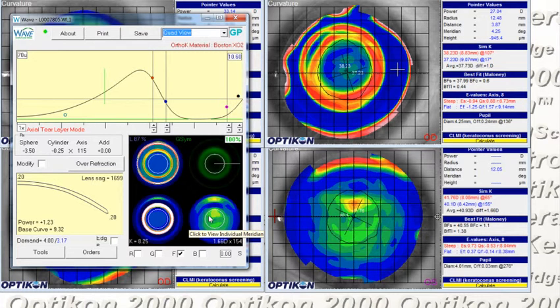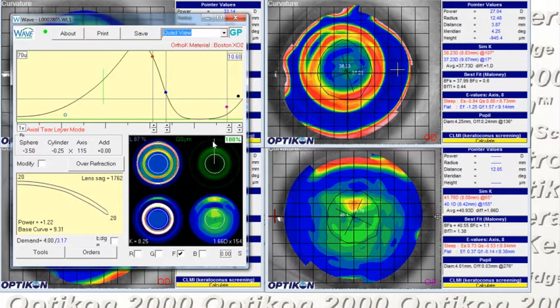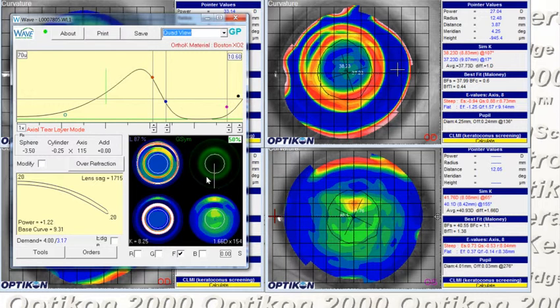So in order to reduce how much cylinder we're correcting, what I would recommend doing is going into 50% mode and just lifting the periphery of the lens in the superior and inferior meridians. We're going to give ourselves approximately 10 microns of clearance underneath the lens. Oftentimes a lens that fits a little bit loose in the vertical meridian will cause cylinder to be induced in the cornea. So in this case we're not trying to induce cylinder, just correct less than we already are with the original lenses.